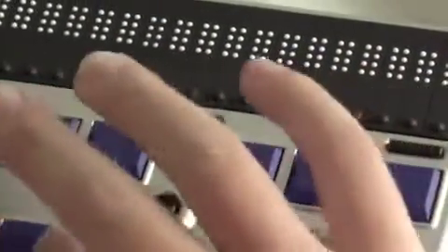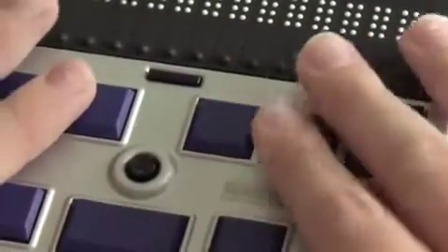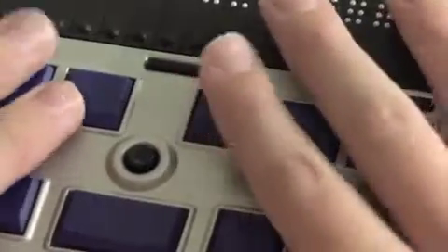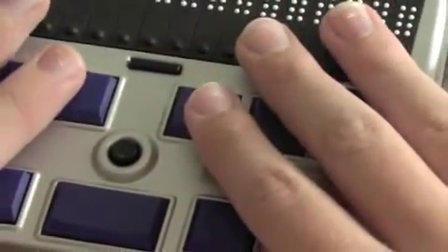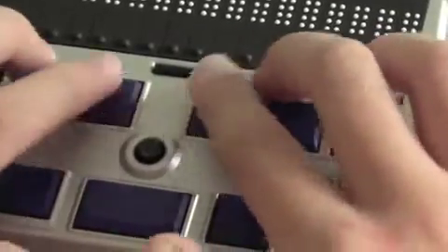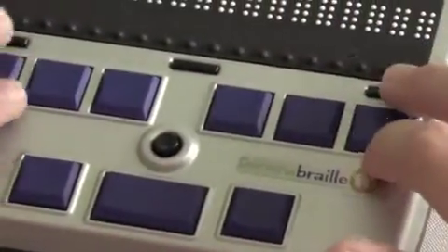Below this, closest to you, you have three more Braille buttons. On the left is shift — what you use if you're typing in computer Braille on the Braille Plus — your spacebar in the middle, and on the right your control key. One thing to mention about the control key and all the Braille keys is that they are straight, all in a row. The shift, space, and control are in a row and the six Braille dots are in a row — they're not slanted and curved like they are on the Braille Plus.